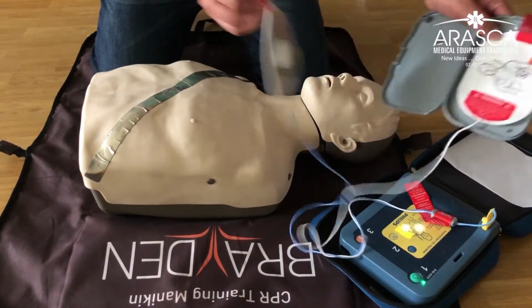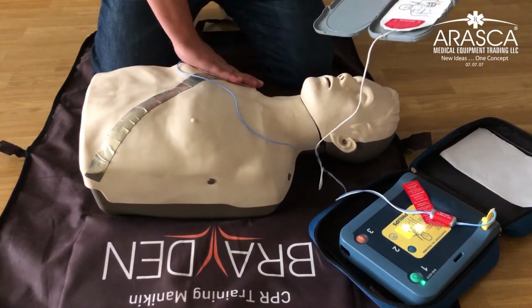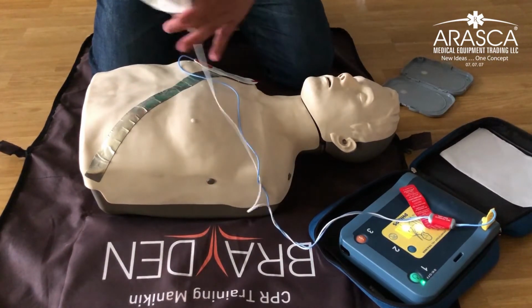Peel one white pad from the grey case. Place pad exactly as shown. Press firmly to bare skin.